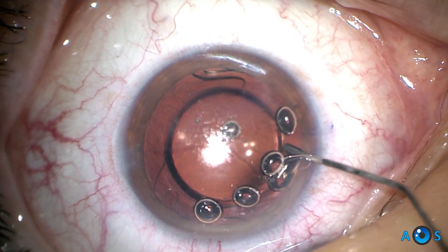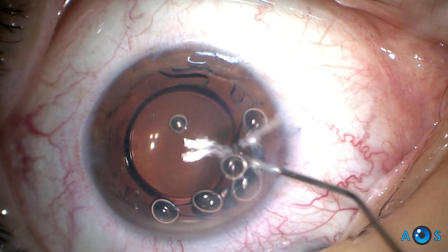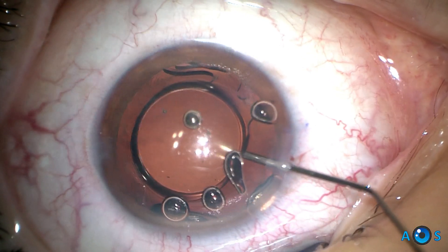Now we create space in the bag posteriorly to the IOL optic, in order to safely accommodate the IOL cutting scissors.